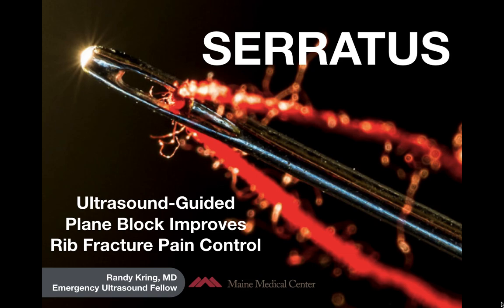Hi guys, this is Randy Kring, Emergency Ultrasound Fellow at Maine Medical Center. This is a primer on the Serratus anterior plane block, an ultrasound-guided plane block that improves rib fracture pain control.